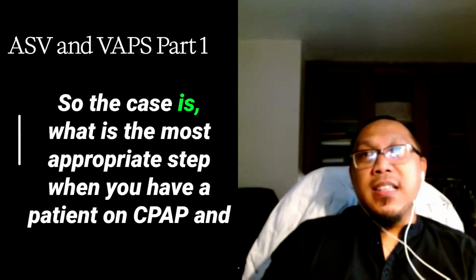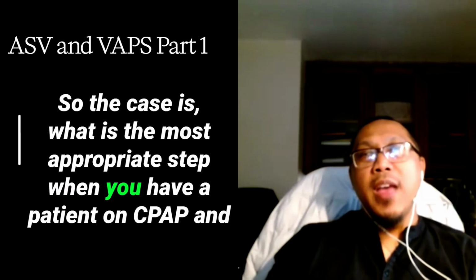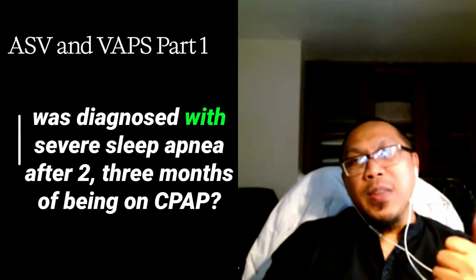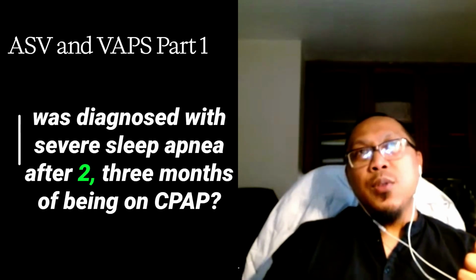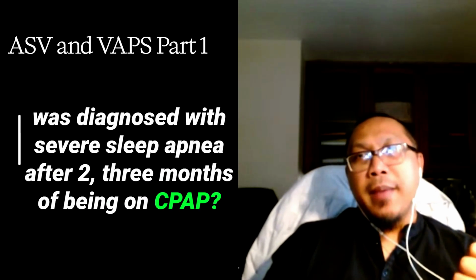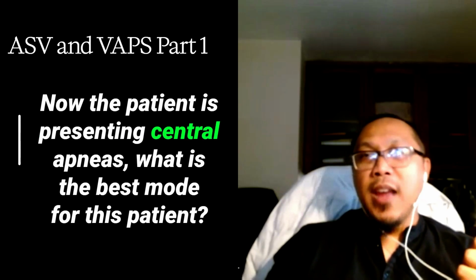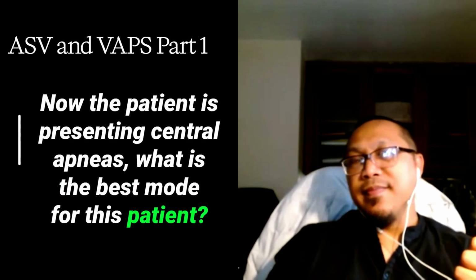So the case is, what is the most appropriate step when you have a patient on CPAP who was diagnosed with severe sleep apnea? After 2-3 months of being on CPAP, now the patient is presenting central apneas. What is the best mode for this patient?